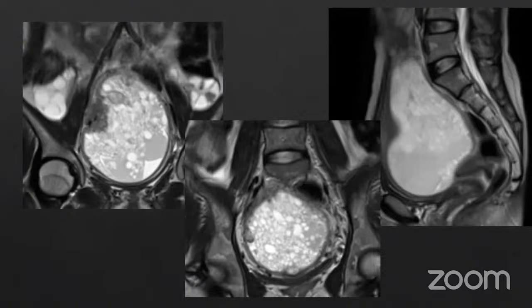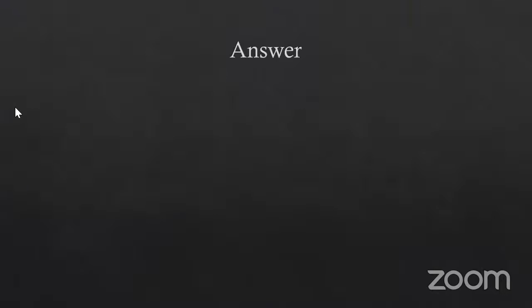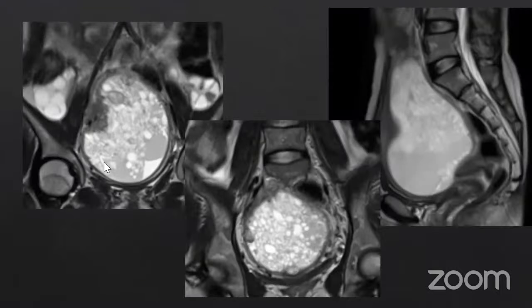Something like small cystic areas, a bunch of, we call it bunch of grapes. I'm giving you hints also. So a lot of differentials coming in. So this is that typical bunch of grape appearance which we see with the hydatidiform mole or gestational trophoblastic disease, that appearance, and this was within the uterine cavity.